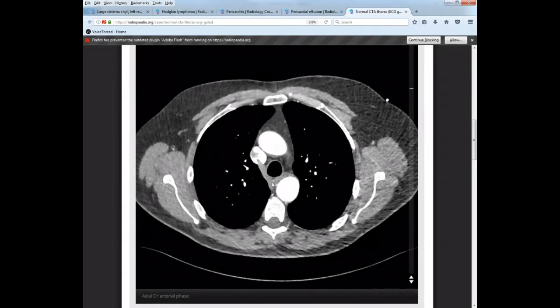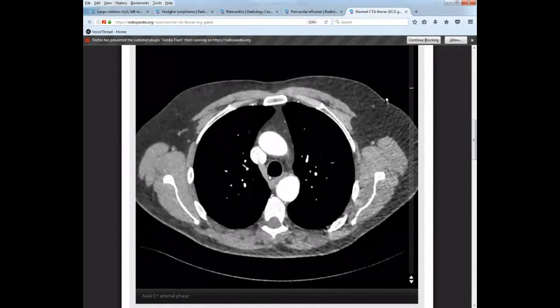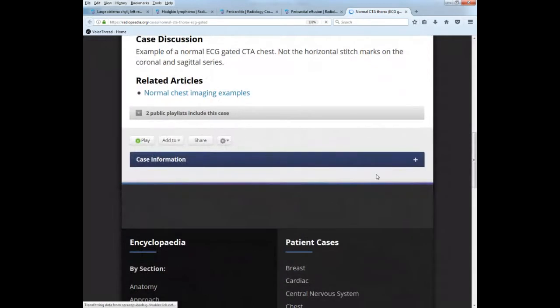It has not received dye yet, because in order for the dye to get there, it would have had to go through the heart and be pumped through the heart. This is why the timing of certain studies is so important, because you have to know where the contrast originates from and where it has to go in order to travel to the rest of the heart, or the rest of the body from the heart.